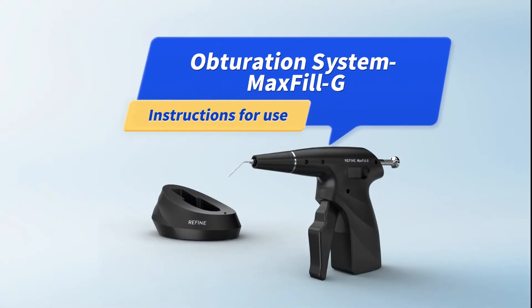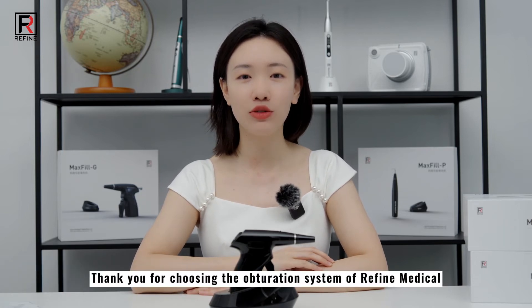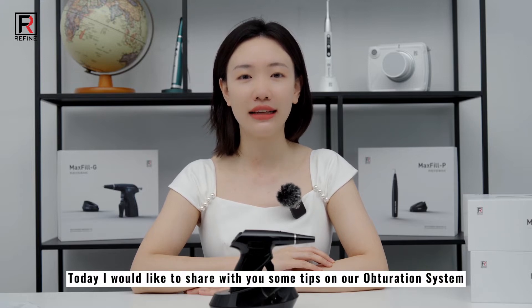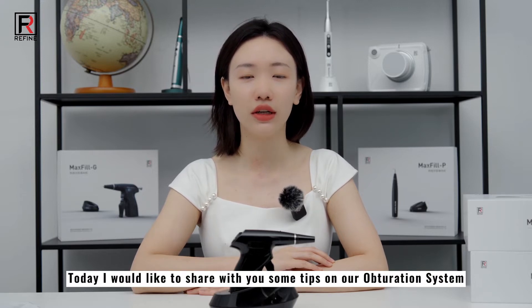Obturation System, MaxFill-G. Instructions for Use. Refine Medical Sales Manager, Su Yanching. Thank you for choosing the obturation system of Refine Medical. Today I would like to share with you some tips on our obturation system.